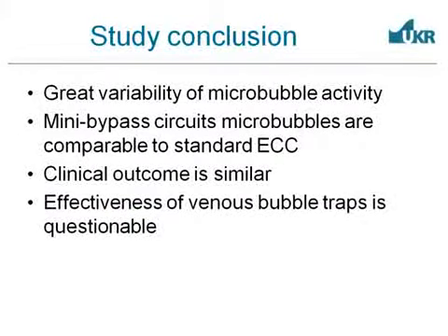So the conclusion of our personal experience was that there is a great variability of microbubble activity, and that the mini bypass circuit bubbles are quite comparable to those of standard ECC. In our hands, the clinical outcome is quite similar, and the effectiveness of these venous bubble traps is questionable.